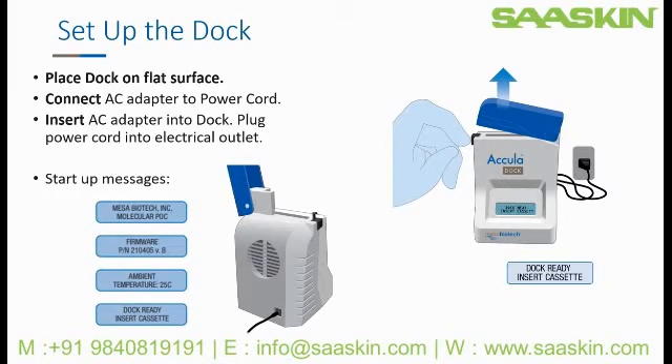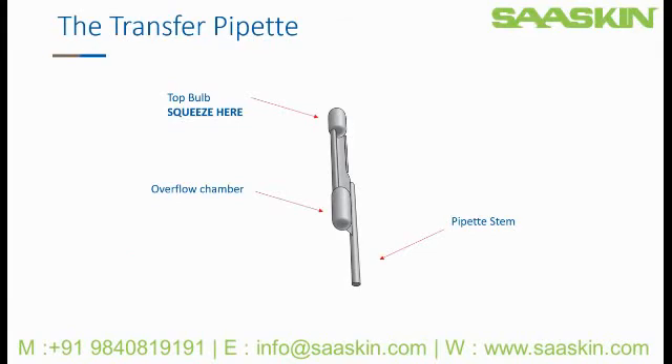When you are ready to run a test, open the dock lid by pressing in the black button and opening the lid. There is a transfer pipette included with every cassette, as well as a bag of extras in the kit box. This will be used to place an exact volume of prepared patient sample into the test cassette. You will use the top bulb to draw liquid into the pipette stem. Extra liquid will move from the pipette stem into the overflow chamber — this is normal. If this is new to you, we suggest you practice with water before pipetting with patient sample.